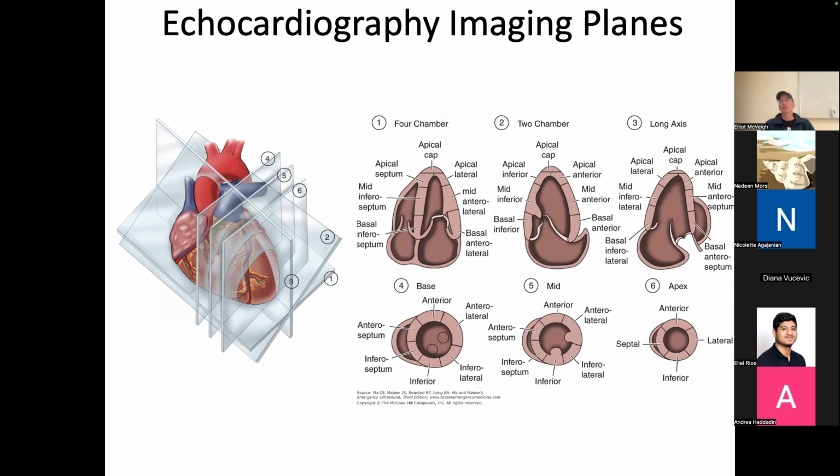And normally when we look at the heart now quantitatively, we'll have 5 different levels from the apex to base through the ventricle. So we'll divide it into 5 or 6 different levels on that long axis view. And then around we'll usually use 12 to 18 angles, something like that. And that way you can make a very nice map of the colors of function.